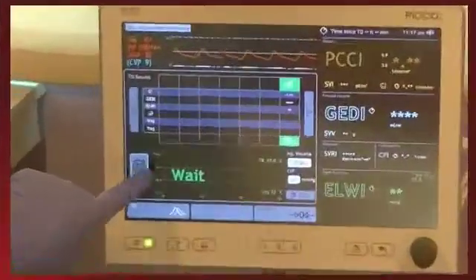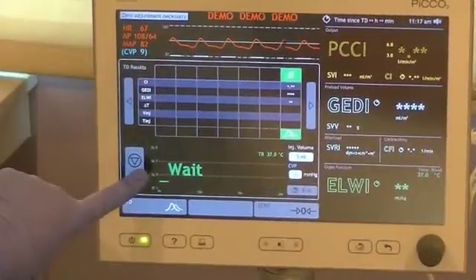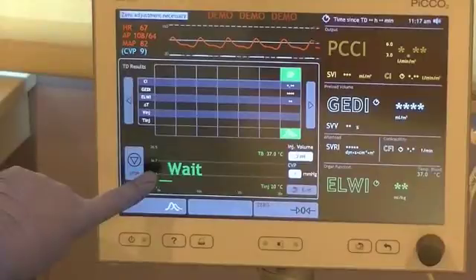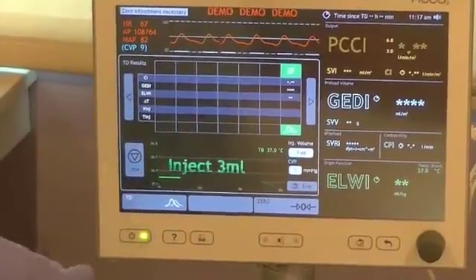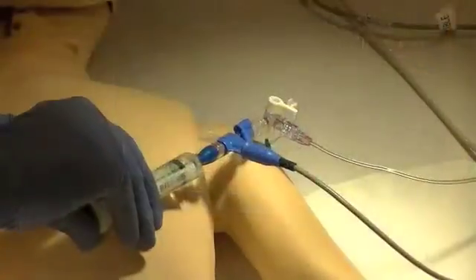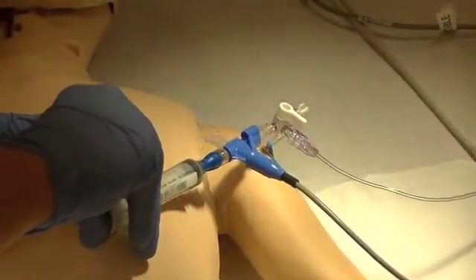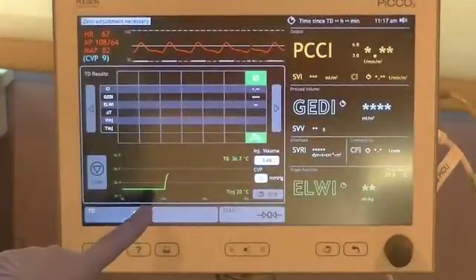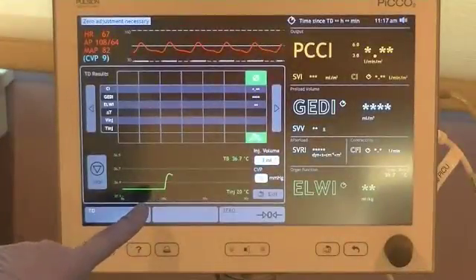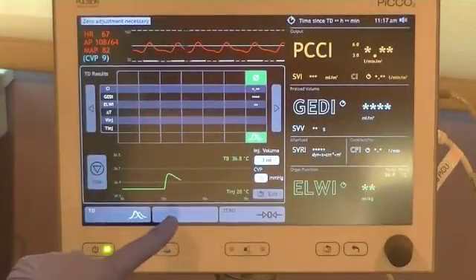Press the Start key. After the command, inject the normal saline rapidly and smoothly. Eventually, the first set of values will be displayed.